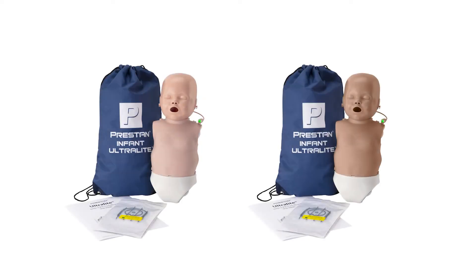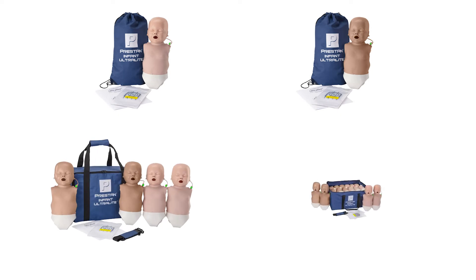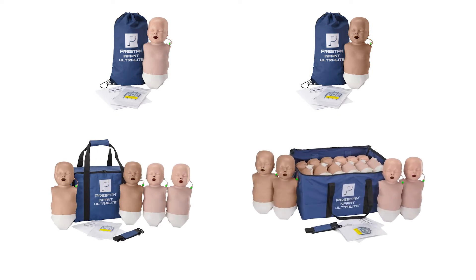The Infant Ultralight Mannequin is available in both medium or dark skin tones, and a single, 4-pack, or 12-pack. Diversity and specialty kits are also available.